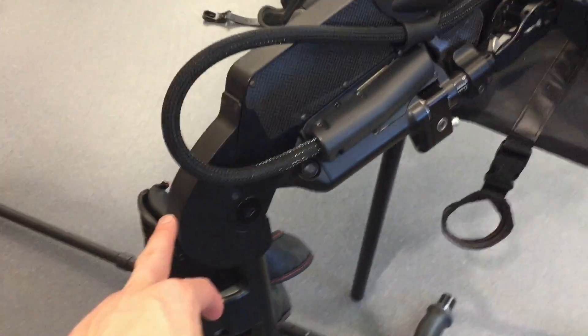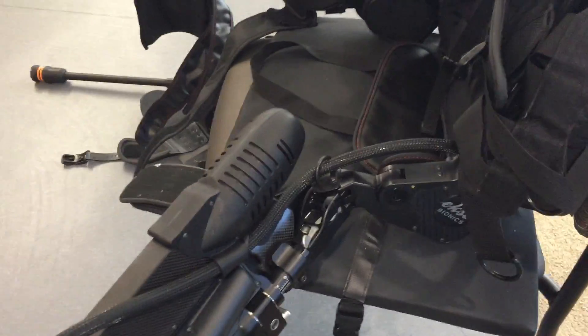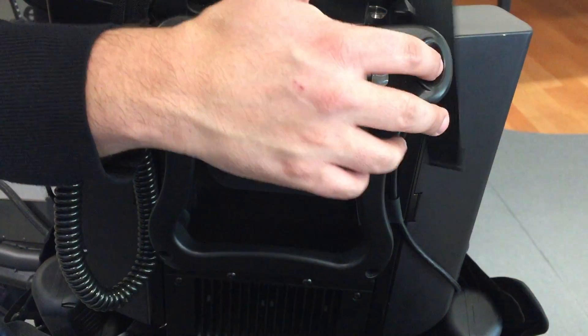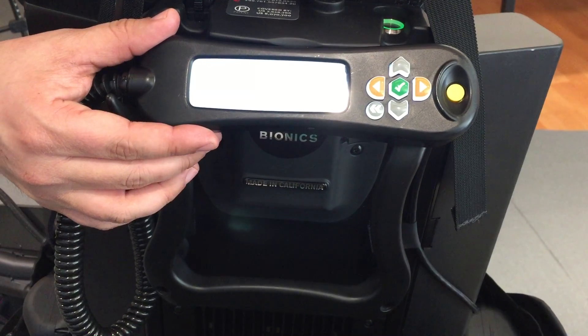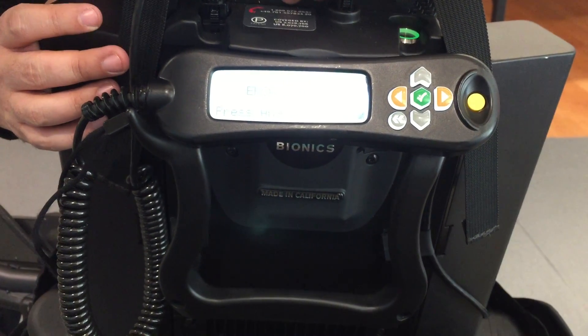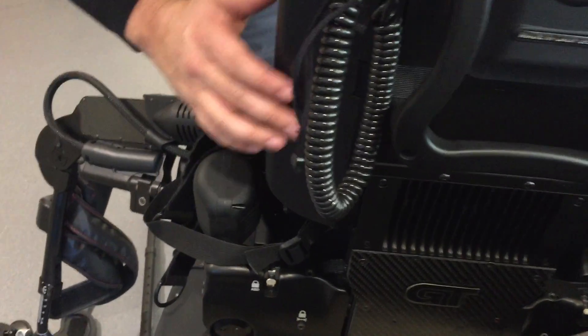This is the knee mechanism right here, and the hip mechanism is right here. On the back, this is the user interface — it's powered off right now. This handheld controller is what we use to control the sit-to-stand and all of the walking features.